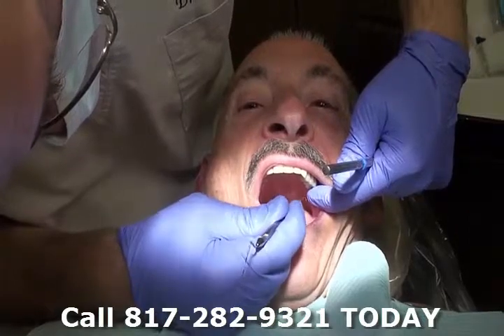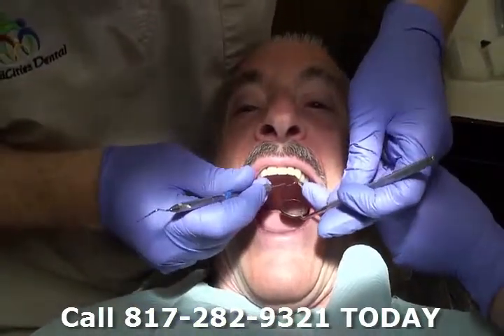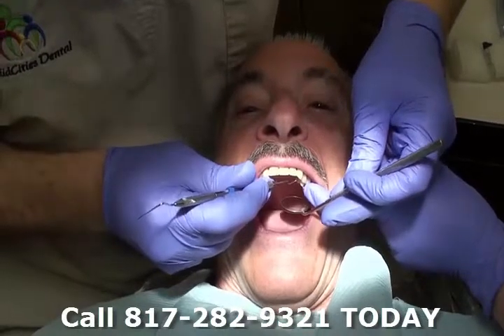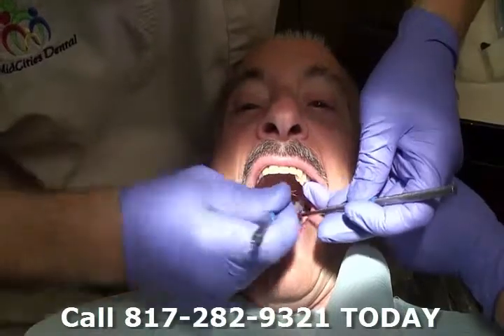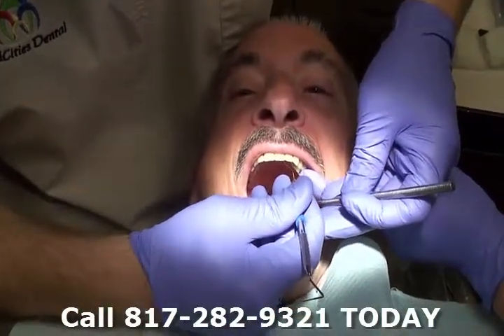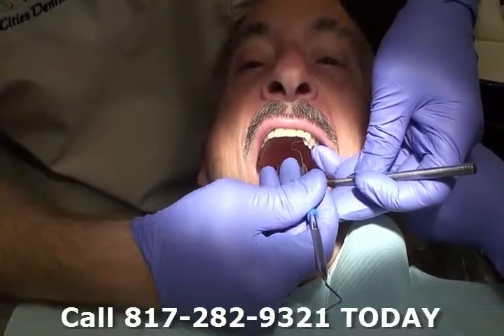I want to take it off. Okay, let me just take it off.